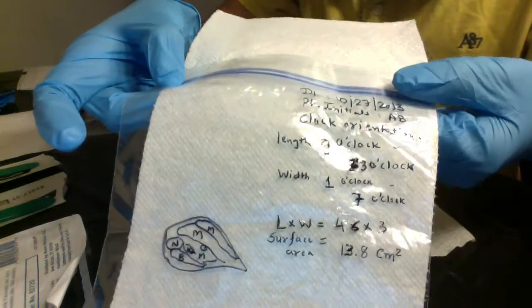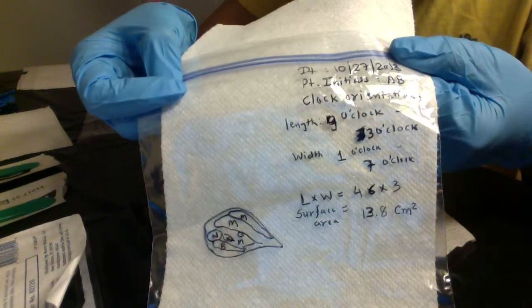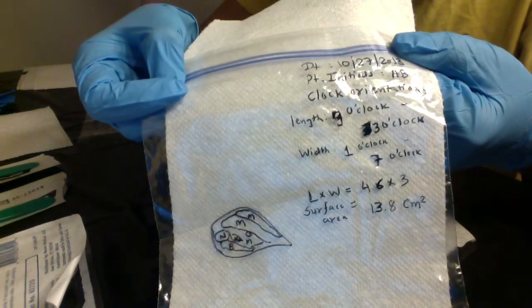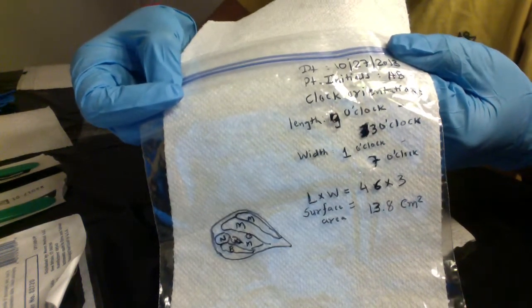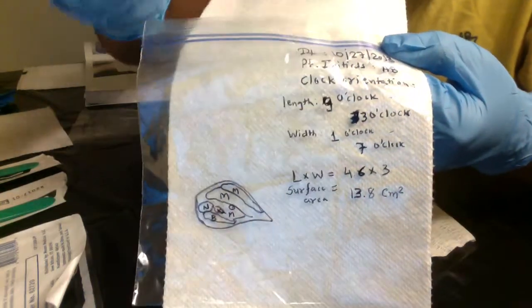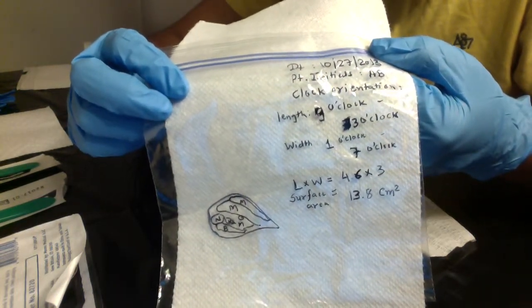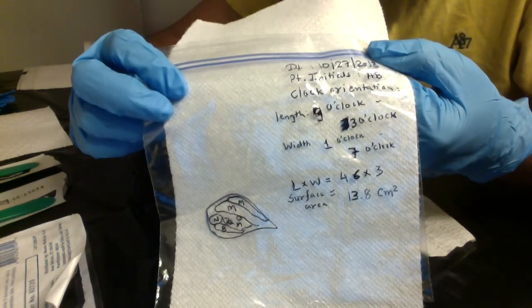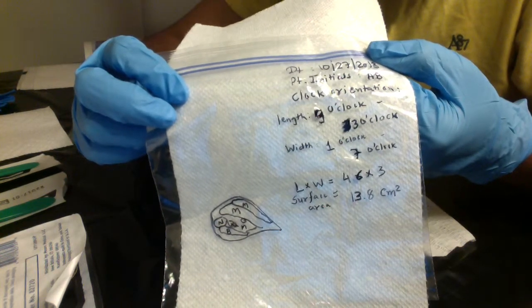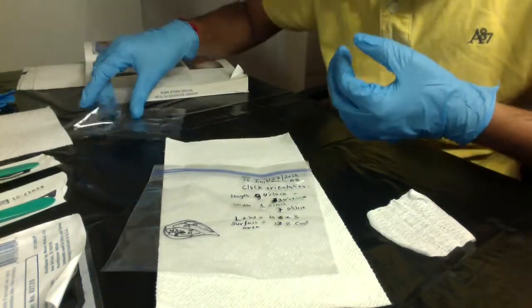Okay, in the top right corner there is a date, name, initials of the patient, clockwise orientation, length is 9 o'clock and 3 o'clock, and the width is 1 o'clock to 7 o'clock. The surface area calculation is right on the bottom, right here, and this is the longest length of the wound and longest width of the wound, which is respectively 4.6 multiplied by 3, which equals to surface area of 13.8 centimeters squared, which I measured using the trace marking here.